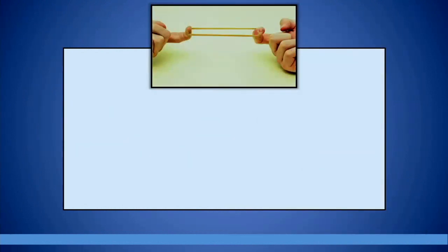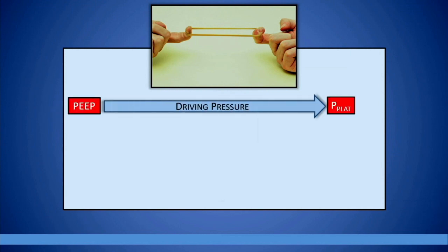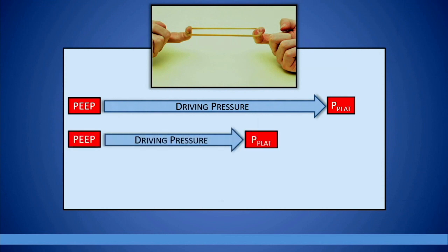And so the idea behind this is just really simple. Medicine's kind of hard, so just make it easy whenever you can. It's how far you stretch this rubber band, right? If I put PEEP and plateau up here and I stretch it really, really far, that's going to kind of hurt that rubber band. However, if I don't stretch it as far, thereby lowering the plateau and thereby lowering the driving pressure, that isn't as harmful. The other one that isn't as intuitive as just decreasing the plateau is actually increasing the PEEP, right?